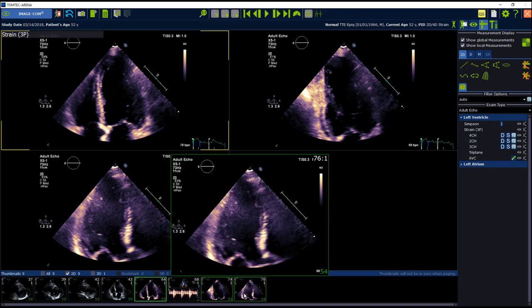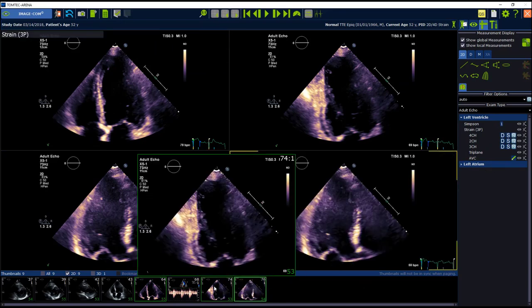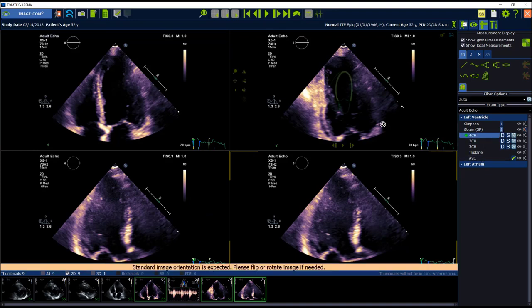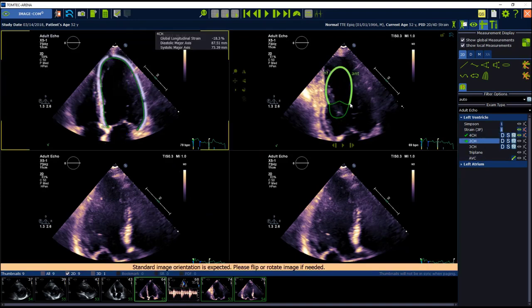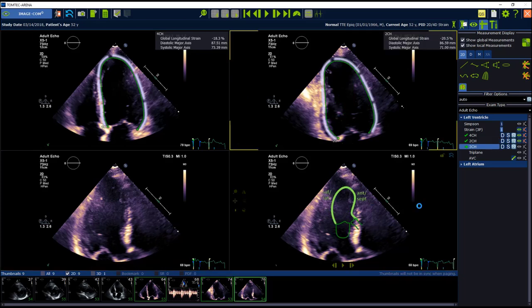I am jumping down for the three-plane strain, so-called AutoStrain. Here with the same workflow, click on the icon on the right. And confirming for two-chamber view. Going back to see the whole measurement package.